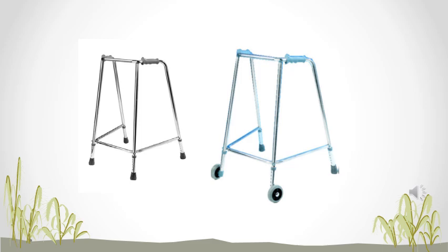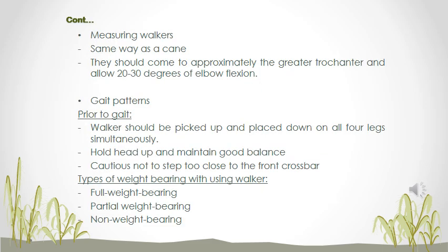Here you will see two different types of walkers. How to measure a walker: it's the same as a cane, where the hand grip comes approximately to the level of your greater trochanter, just a little bit lower than your hip joint, and then the elbow is slightly flexed when the hand is on the hand grip, to an angle of 20 to 30 degrees.